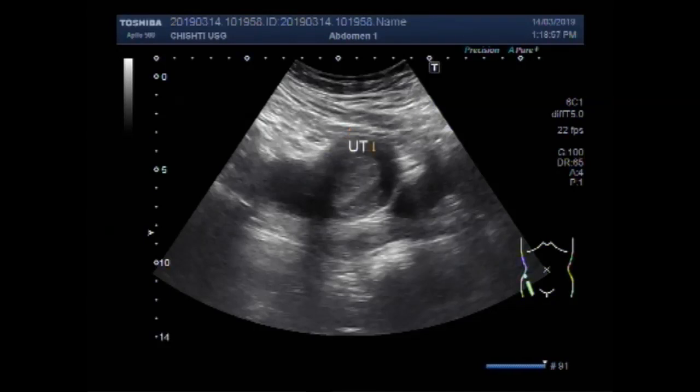This is the uterus, this is the cervix, and this one is the urinary bladder.